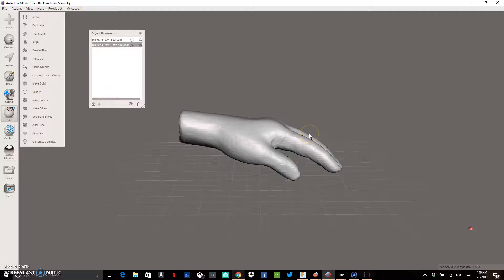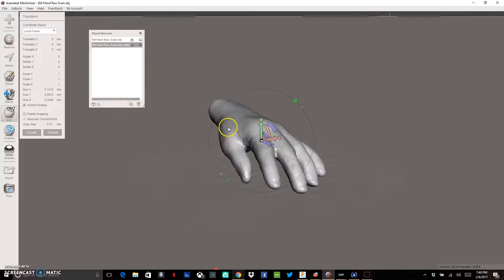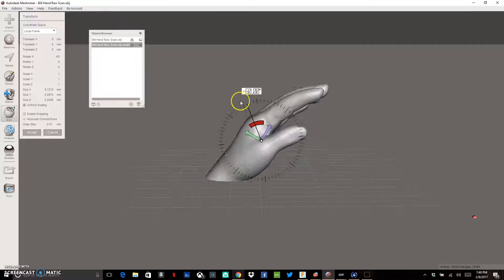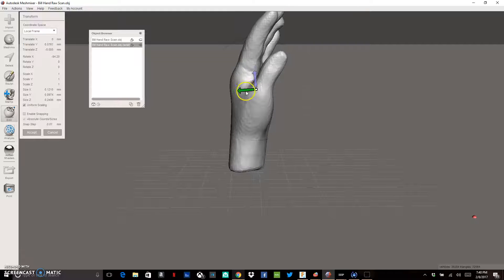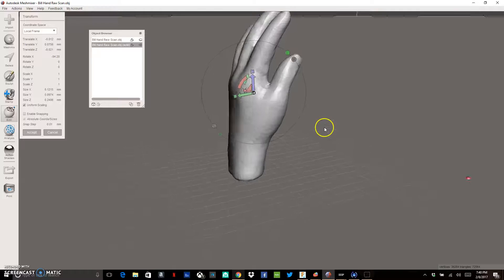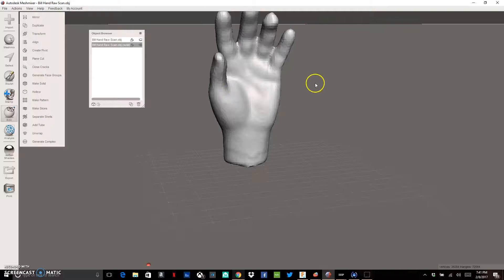Now I want to orient the model so it's sitting straight up and down like it would on my printer when I actually print it. I'll click on Transform, which pops up a tool window. I can rotate it using the arc handle to get it sitting straight up and down. You'll notice some of it goes beneath the little plane — think of that as the build plate. I'll use the arrows to move it up, then accept.